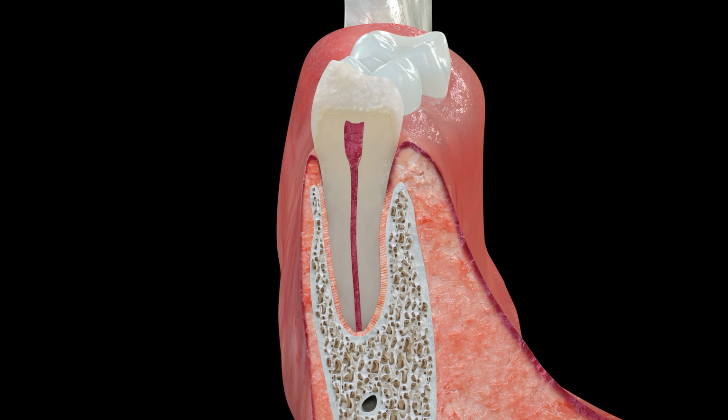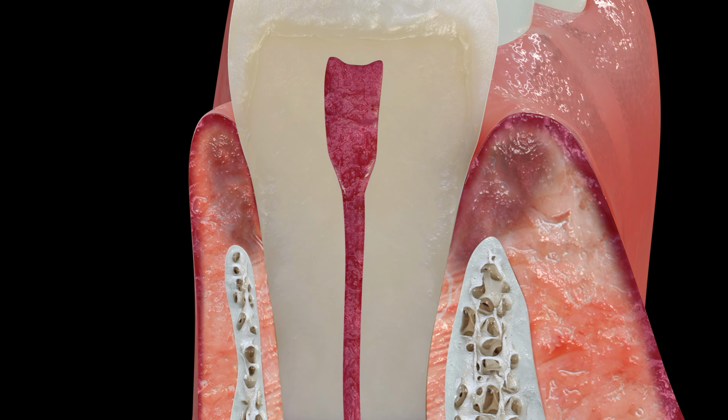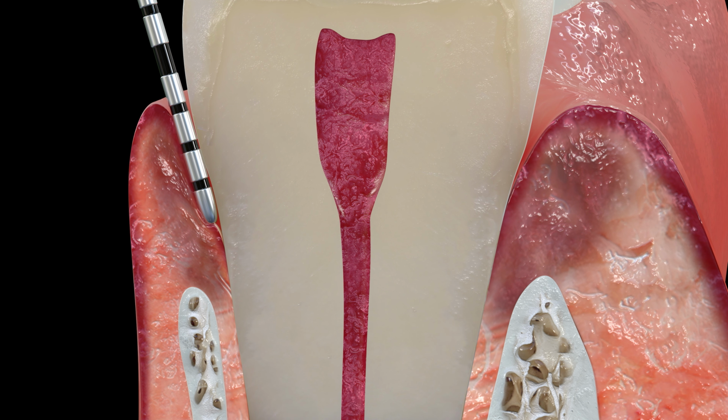In plaque-induced gingivitis, we observe increased pocket depth, inflammation, bleeding, and loose epithelial attachment and connective tissue fibers, leading to penetration of the probe into loose connective tissue fibers. At this stage, no bone loss and attachment loss is present, and supracrustal connective tissue attachment is at the level of the CEJ. Therefore, with treatment, plaque-induced gingivitis is reversible to original health.